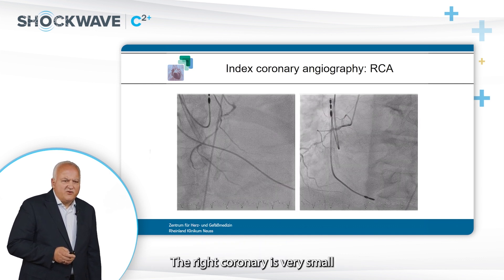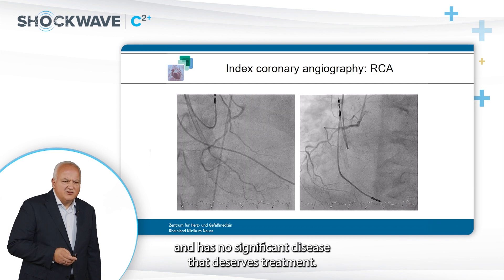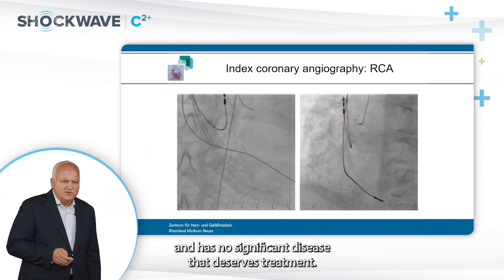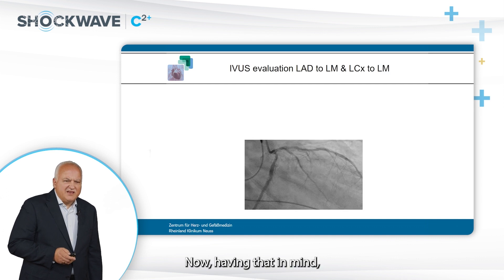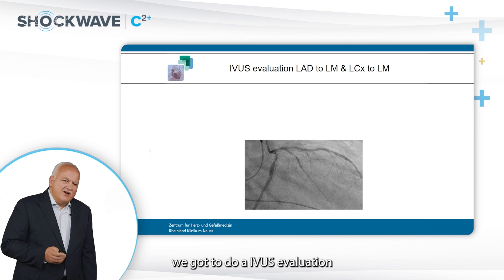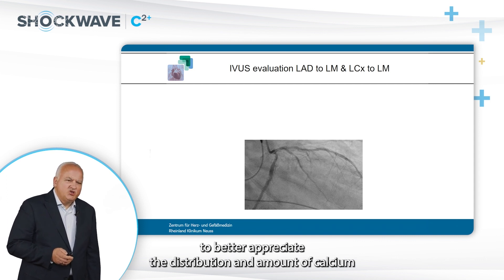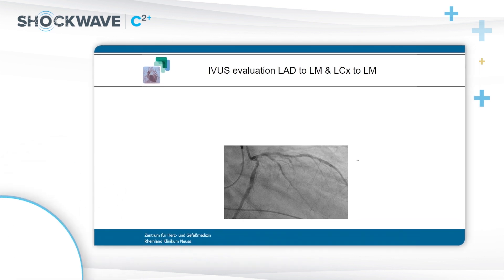The right coronary is very small and has no significant disease that deserves treatment. Having said that, we need to do an IVUS evaluation to better appreciate the distribution and amount of calcium in the left coronary artery.